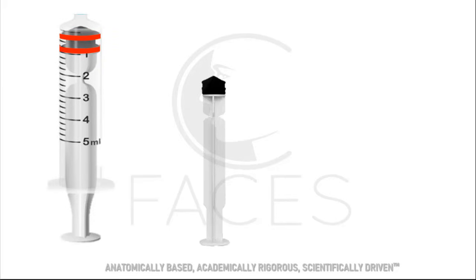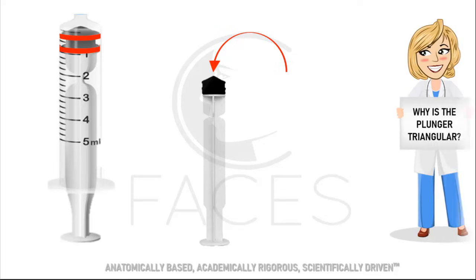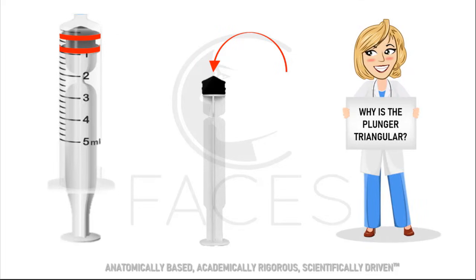But you may have noticed that the stoppers have a triangular shape at the top and I'm frequently asked if the volume is measured from the tip of that apex and the answer is no. The volume is always measured from the top ring.